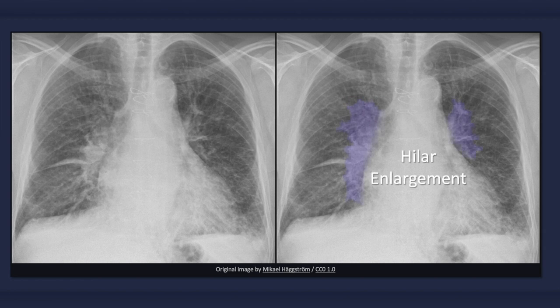You may have also noticed the prominence of the hilar region and the widening of the vascular pedicle in this radiograph. The fullness of the right hilum is particularly evident, whereas the left hilum is predominantly obscured by an enlarged cardiac silhouette. Unlike with lymph node enlargement, in which case the hila can appear as a large lumpy mass, the hilar region in this X-ray has irregular borders due to thickened outward branching vessels. The increase in hilar size and vascular pedicle widening are due to pulmonary venous congestion.